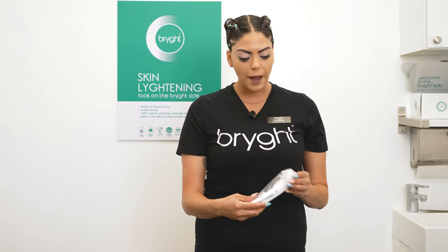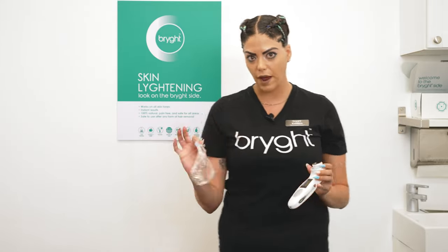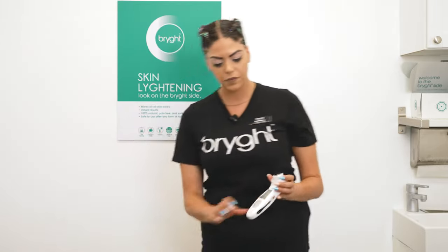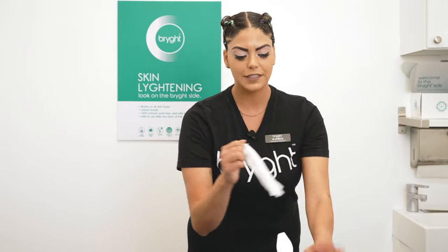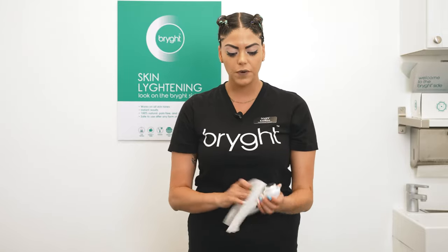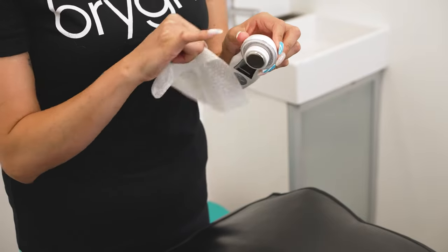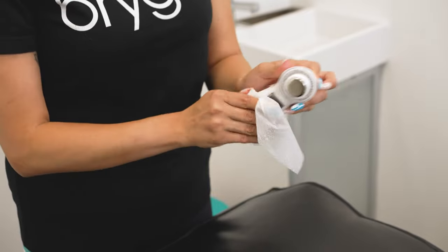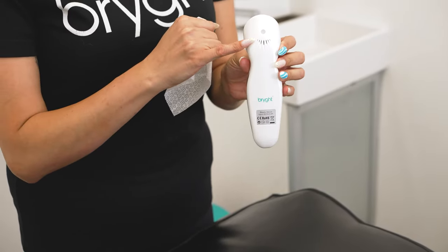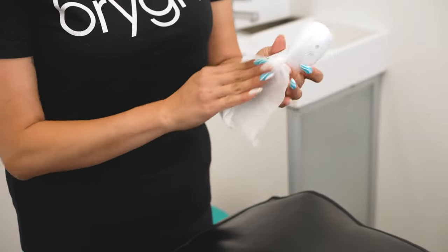Once you've finished your treatment you'll have residue and product over your wrap — go ahead and remove the wrap after each and every service. Never reuse the wrap for any other service. Then make sure you sanitize — you can use Cavicide Excel or Lysol wipes. Go through the whole wand especially the ridges in the middle where product gets stuck. The most important part: do not go over the fan, as you don't want any chemicals to drip inside and ruin the wand, but you can work around it.